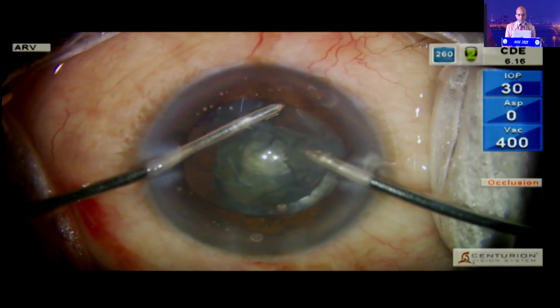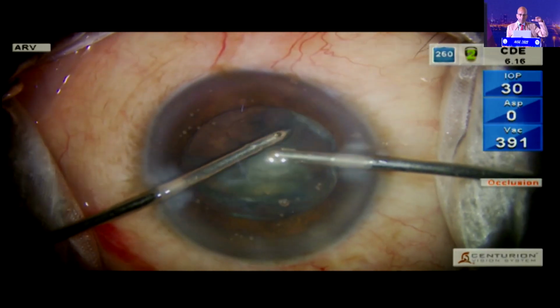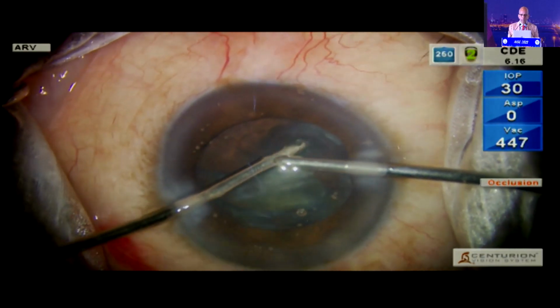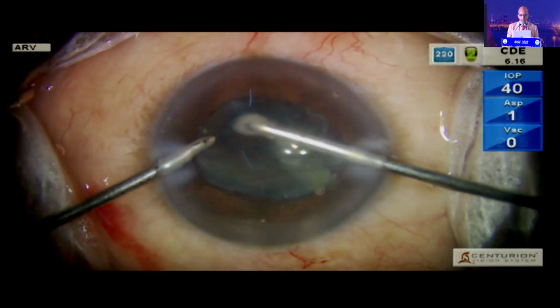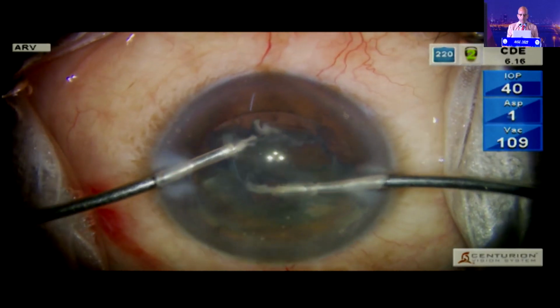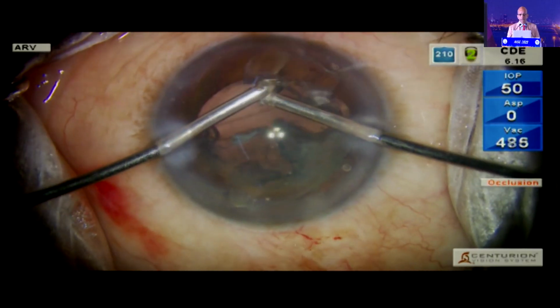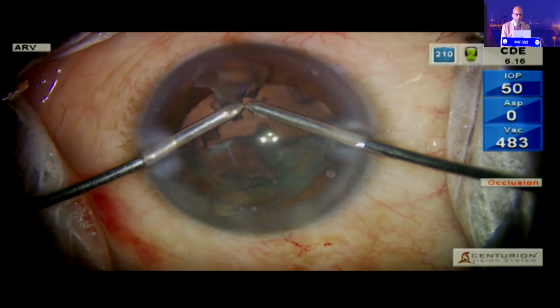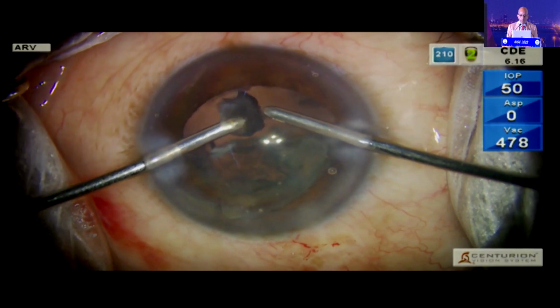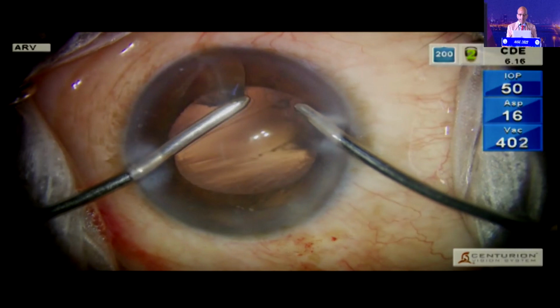Now I raise the bottle height from 20 to 30, and sometimes I go to 40, because now I have fluid pressure sitting on that exposed vitreous. I'm not worried about unequal hydraulic pressure because it's all communicated well, and that posterior polar material is coming out, as you can see. And the bimanual technique, once again, really is a great help in maintaining the contour and not utilizing the valve effect of the main incision. So that's protected.